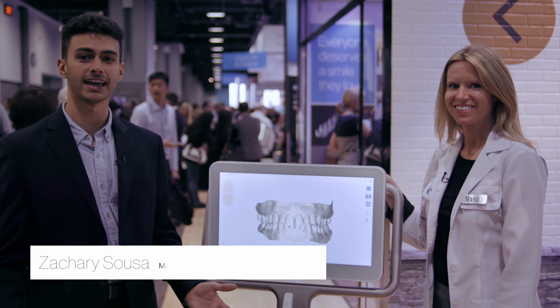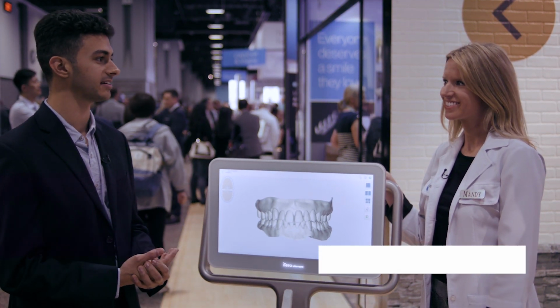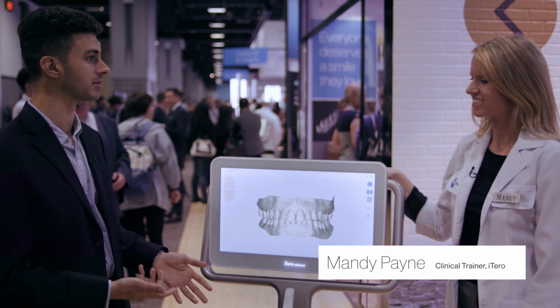Hey everyone, we're here at AAO. I have Mandy Payne here to walk us through the multi-bite scan feature. Mandy, if you want to take us through and give us a demo of it, that'd be awesome.